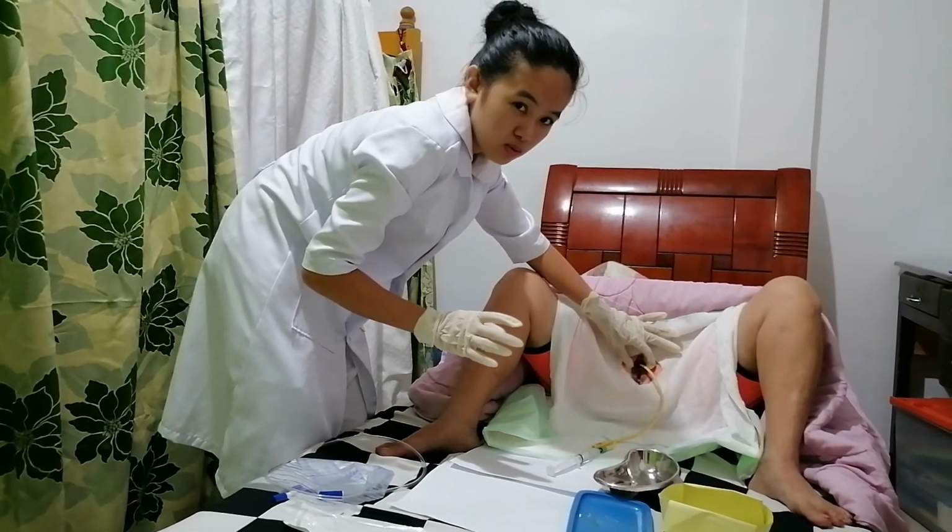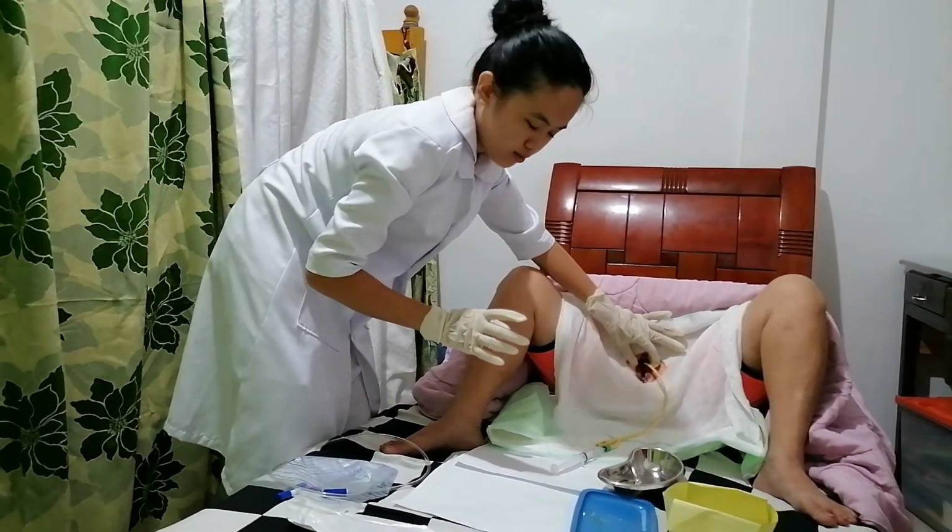After that, I'm going to inflate the balloon.